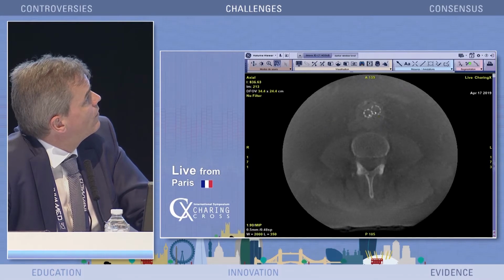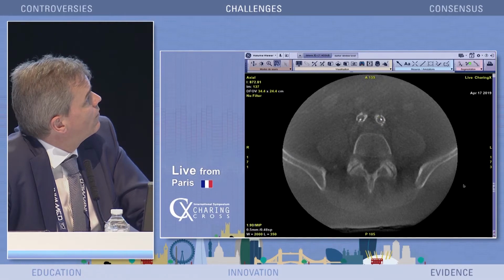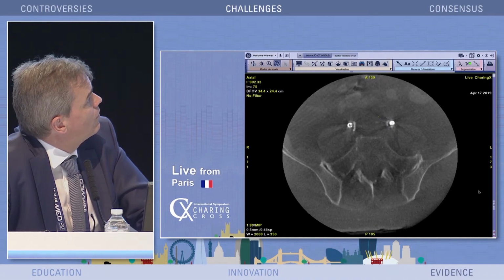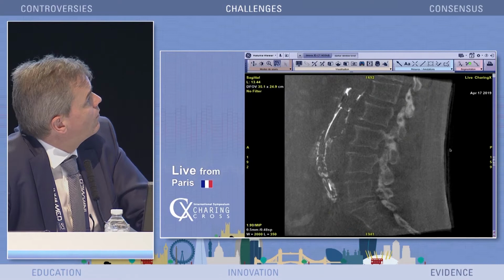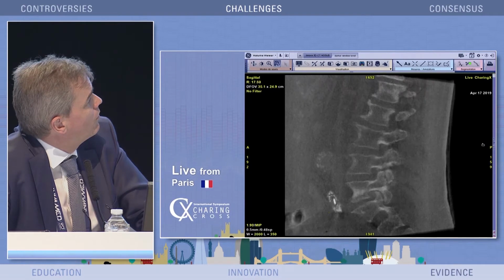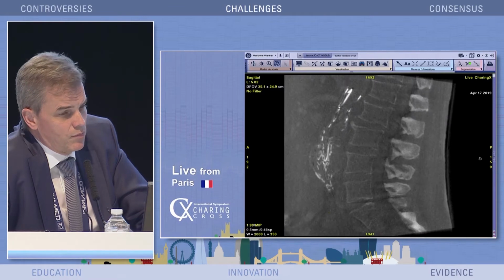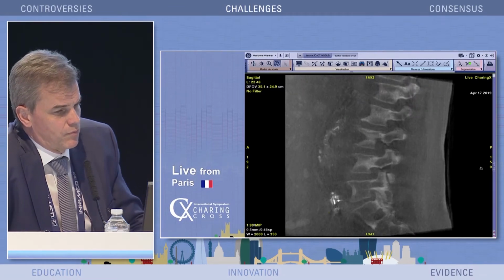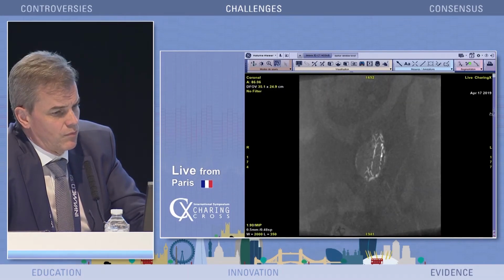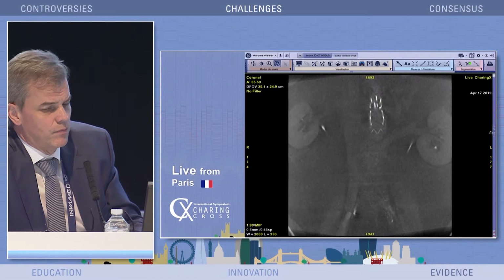Go on, Dustin, hurry up a little, go down. So you see that almost nowhere because we flushed, and you can see the plaque, but everything is nicely open thanks to the kissing angioplasty with 12/4. Can you switch to coronal and sagittal view, please? You see, we check that there's no conflict between the limbs and that the limbs are nicely open. One, and then the other limb. And now the coronal view, please. And you can see again that both limbs are nicely open, so I don't need to stent them. I'm happy with the way those limbs are nicely open in the diseased iliac.